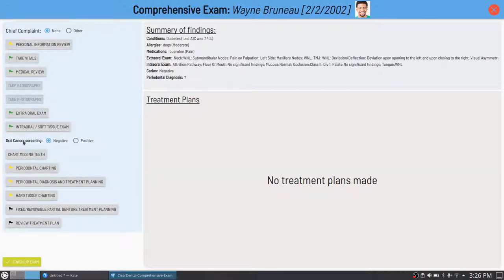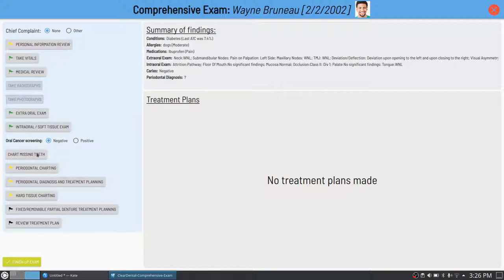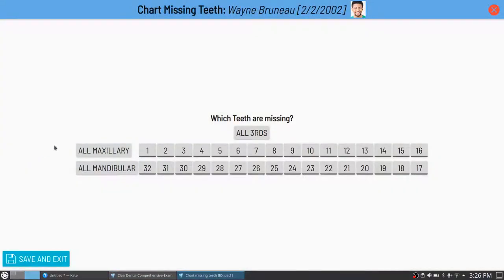Oral cancer screening is its own line because it's technically a combination of the intraoral and extraoral exams, so rather than put it in either module, it stands alone — you can record positive or negative. Chart missing teeth doesn't have a flag because not every patient needs this module; it's for situations where multiple teeth are missing and will make periodontal charting easier. For this young patient, I'll just say all thirds are missing — teeth 1, 16, 17, and 32 are now recorded as missing.